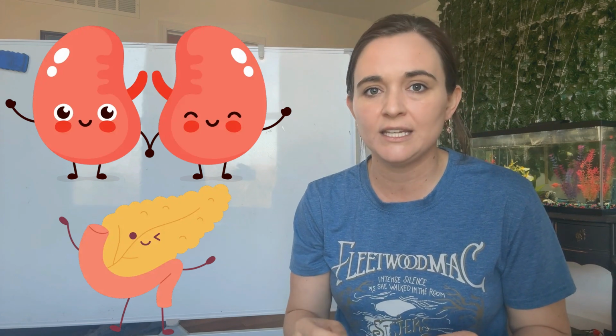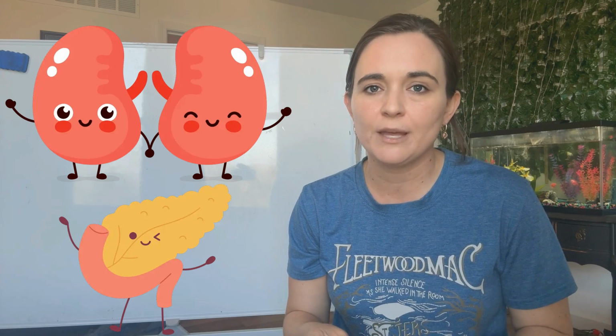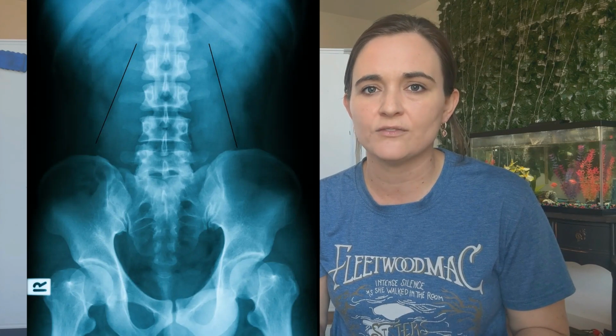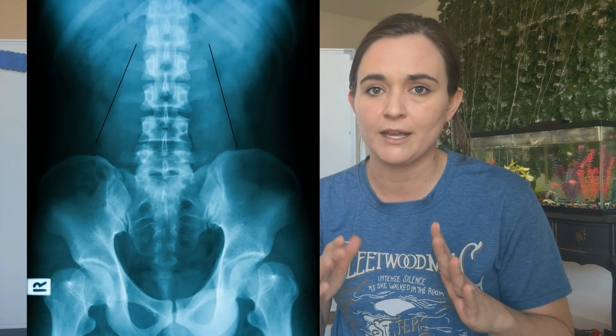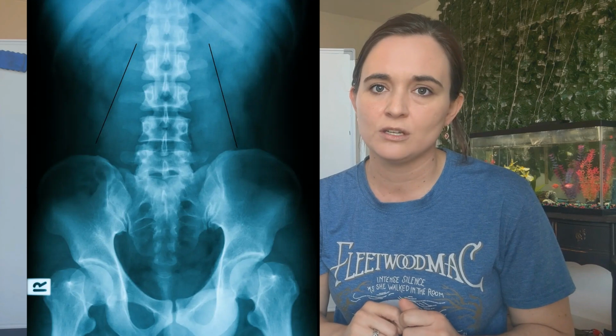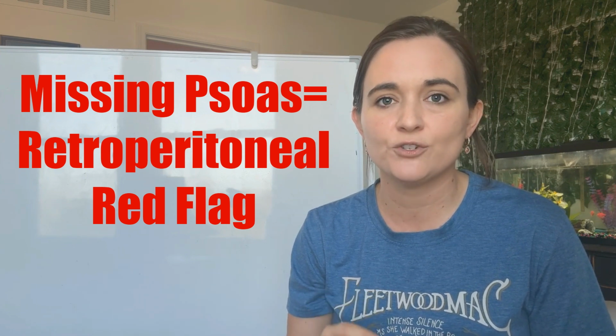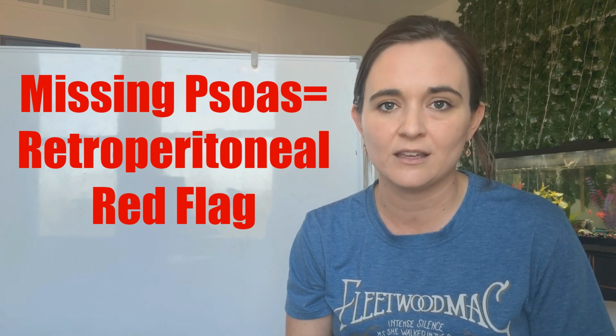But wait, there's more. Behind all of this, you've got the retroperitoneum. That's home to the kidneys, pancreas, and the aorta. On your image, if you see faint outlines of the psoas muscles next to the spine, great. If they're missing, that could be a sign of hemorrhage, abscess, or aneurysm. Let me repeat that. Missing psoas shadows equals retroperitoneal red flag. Anatomy is your map. Know it well. It'll guide your eyes before you ever need a radiologist.